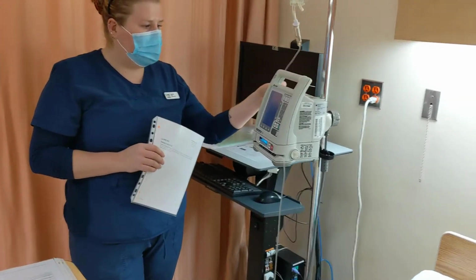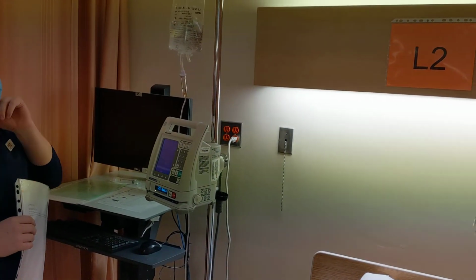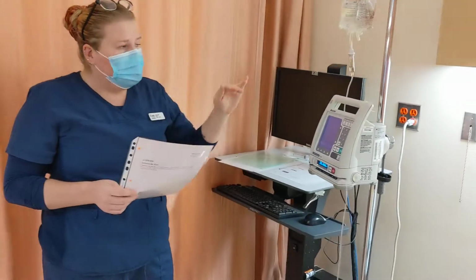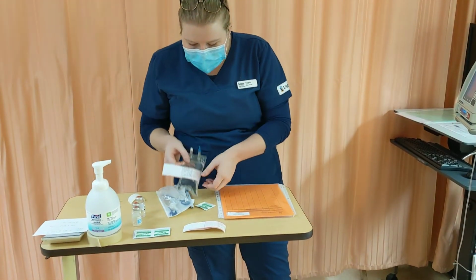This line has been dated in time, so we're good. It's not expired. I'm also going to check my primary infusion, so it's normal saline at 25 cc's an hour, which is correct. So we got that, and it's not expired, so that's good. After I've double checked all of that, I'm just going to ask the patient to excuse me so I can go ahead and do my third check here.